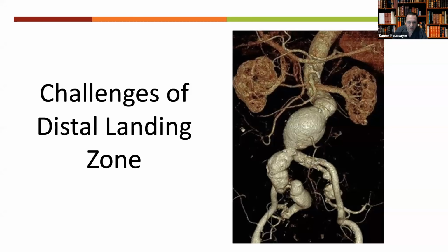Okay, any question about aortic bifurcation? Hi, Dr. Qusair, how are you? Yes, go ahead, please. I just want to ask regarding the aortic bifurcation. If it's very calcified, what do you think about intravascular lithotripsy in this case? Because you're basically cracking it without using very high pressures, and you're minimizing the risk of rupture. Have you used it in your practice?